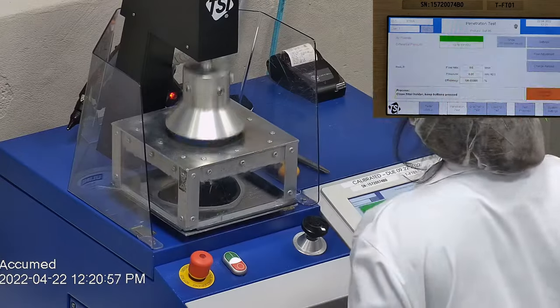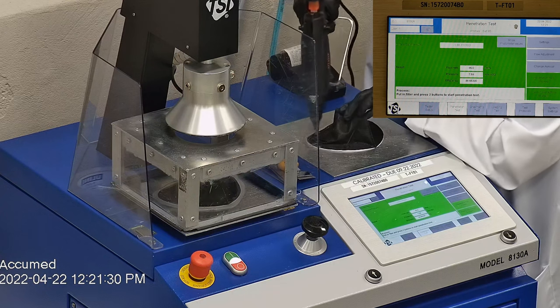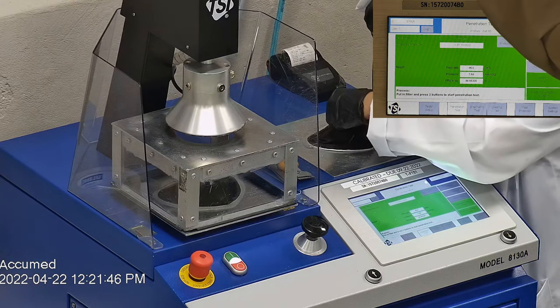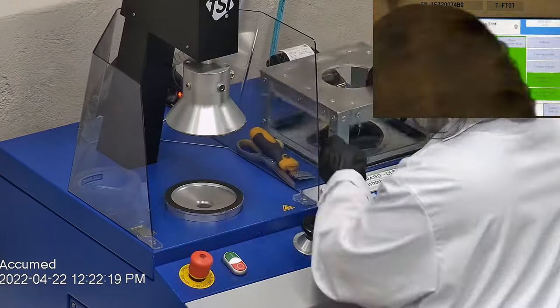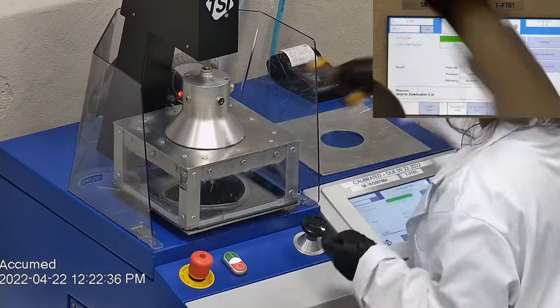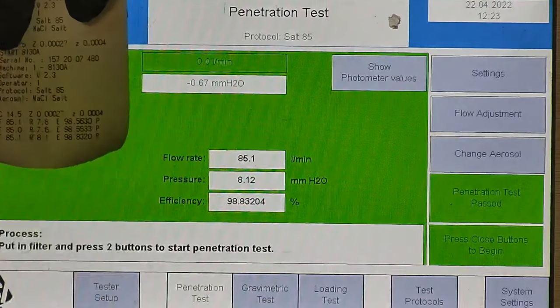The TSI machine is now conducting its test, which tests for both particle filtration efficiency and pressure drop. Let's go over the results. F stands for air flow rate, which we test at 85 liters per minute. R is for resistance, also referred to as pressure drop — this correlates with breathability, so the lower the number the more comfortable and breathable the respirator is. E stands for filtration efficiency percentage. As shown, the filtration percentage for all three samples was 98.56% or above.